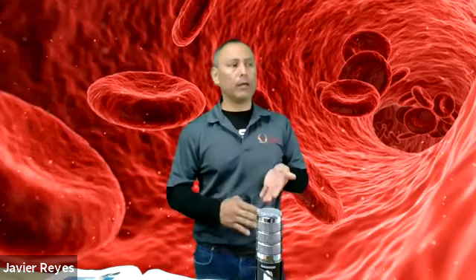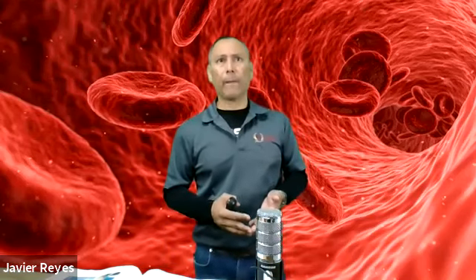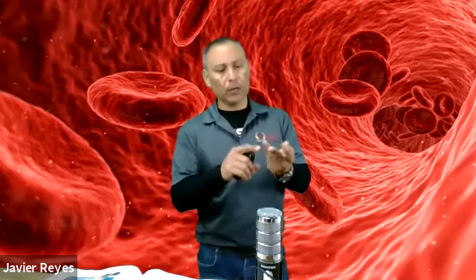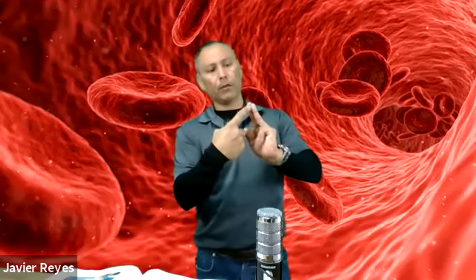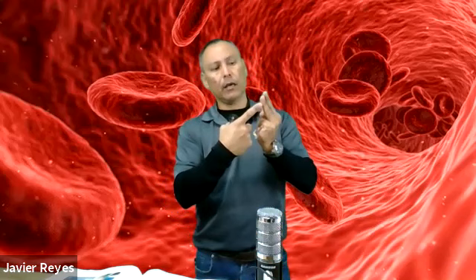Do not puncture over any scars or cuts or anything like that, as you're not going to get any blood return. If it's swollen, obviously, just like in venous punctures, you do not want to perform punctures over swollen areas because you're going to be contaminating your specimen, or you might even cause infections. On adults and older children, use the palmar surface of the distal end segments of the middle and ring fingers, which is the central fleshy portion of the finger. So you're going to try to puncture the fleshy part, not the side. You don't want to go there because there's a bone there and you might cause an infection of the bone, which is called osteomyelitis.